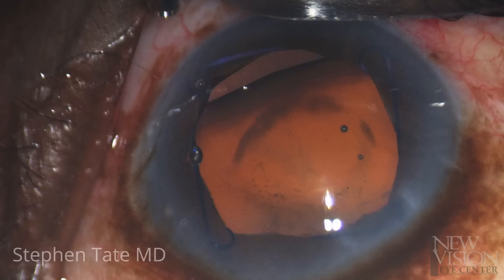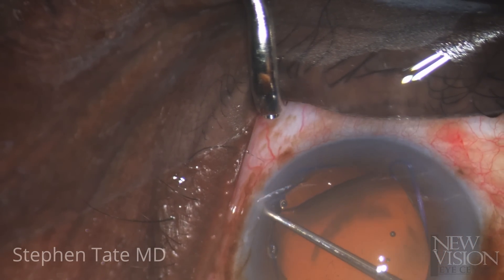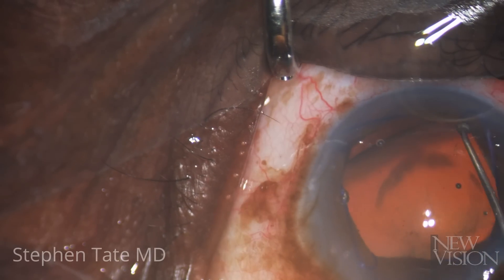With manipulation of the ring, a flat segment of the lens equator flanked by two small bulges — the Mickey Mouse sign — was noted, indicative of congenital zonular defects in colobomas. These types of defects usually have healthy and intact zonules except in the affected area.